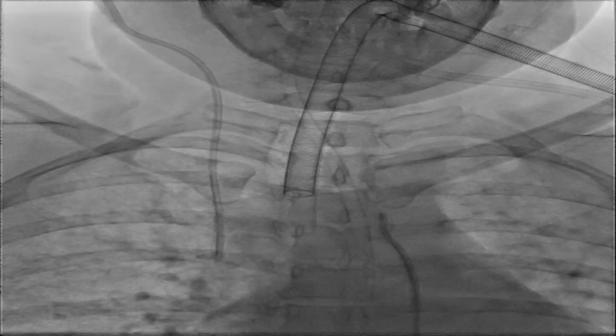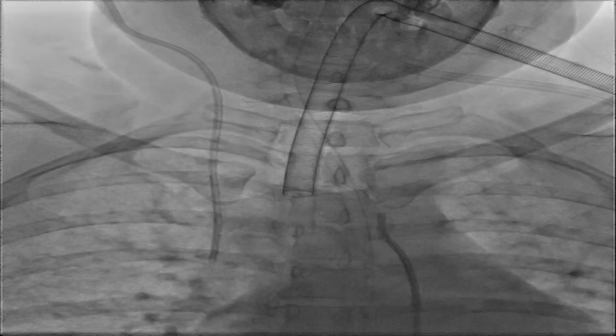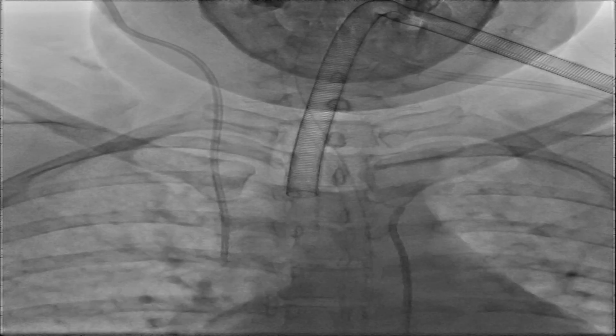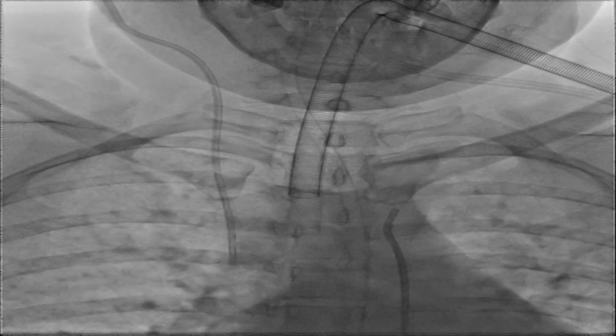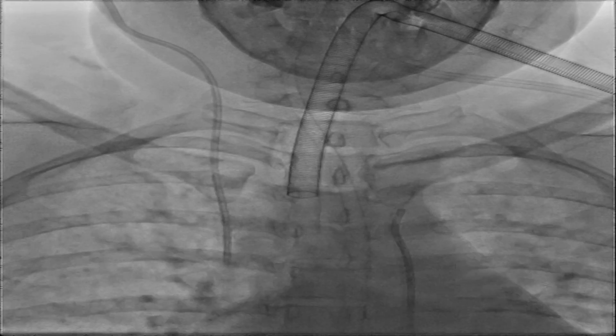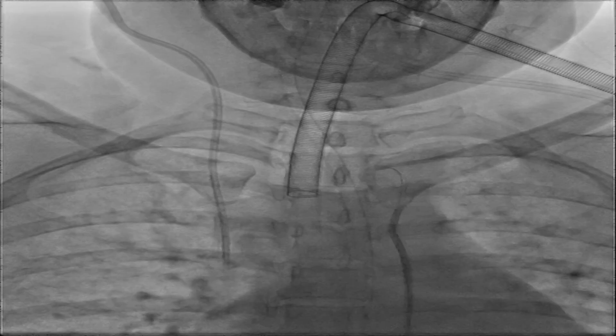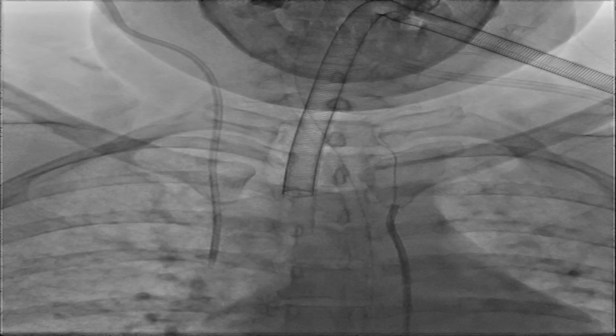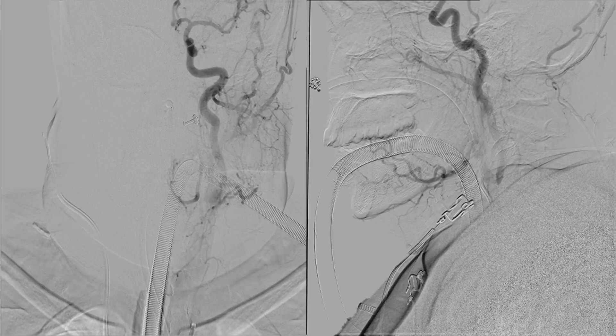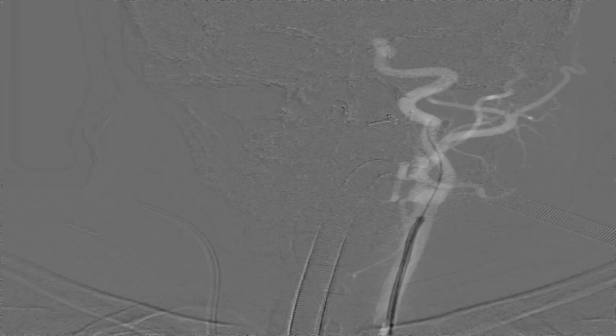For the left carotid artery, we take the wire inside the catheter, rotate the tip of the catheter toward the patient's left side, and withdraw the catheter slowly — it will automatically hook the left common carotid artery. We advance the wire and pass the catheter over it. We take a DSA of the left common carotid artery, take a roadmap, and advance the catheter into the left internal carotid artery and external carotid artery one by one, taking biplane DSA of both.